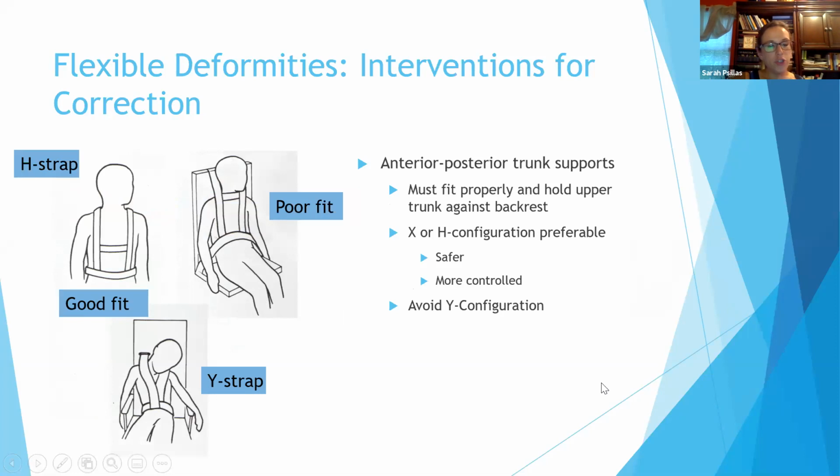You also can use strapping for the spine. You just want to be careful with how much, if clients are okay with it. A lot of times clients don't love straps. They don't love straps, but it's an option. I honestly use this a lot more with kids than I do adults.